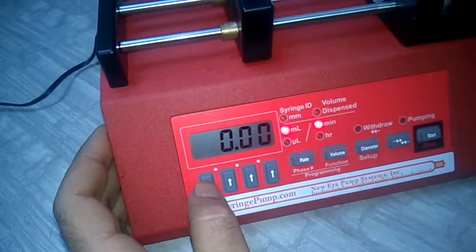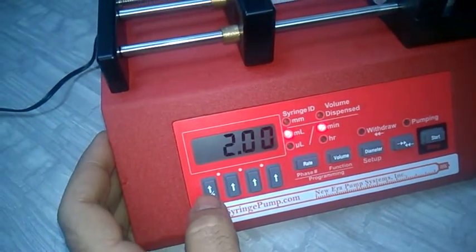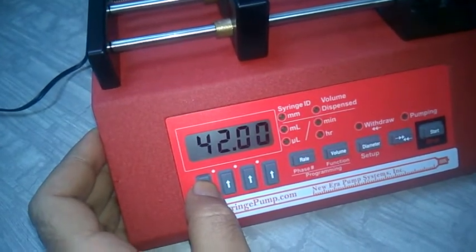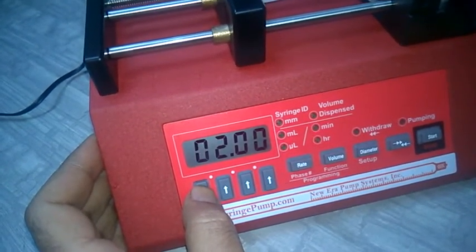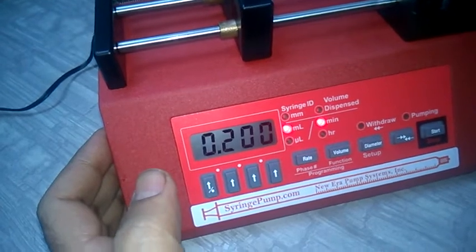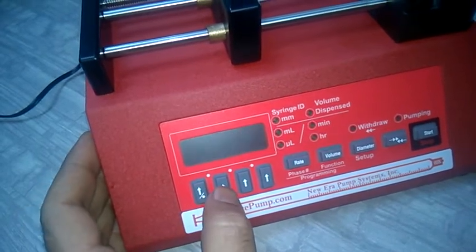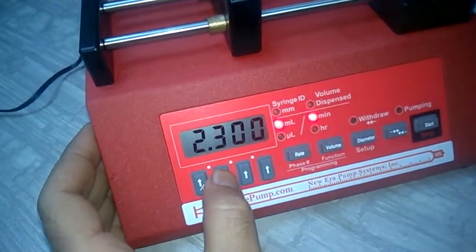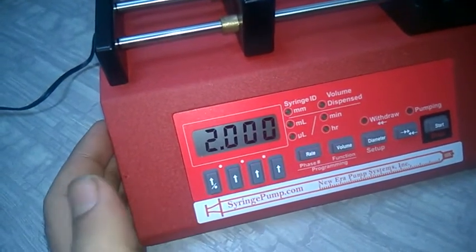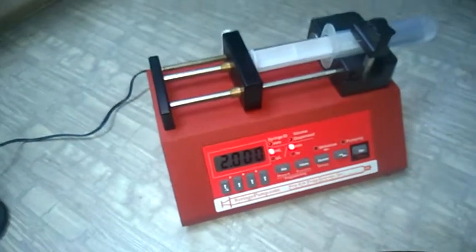We have selected ml per minute. Now to enter the value of 2 ml per minute, press 2. Use the right arrow key to move the cursor if needed — you will see the arrow position change on the display. Adjust the digits so that the display reads 2.0 ml per minute. Now the rate is set to 2 ml per minute and everything is ready.